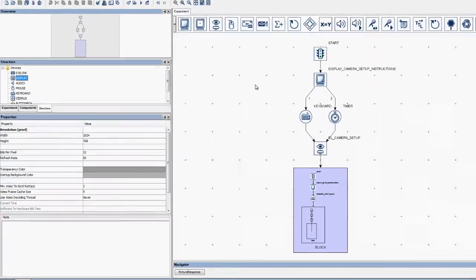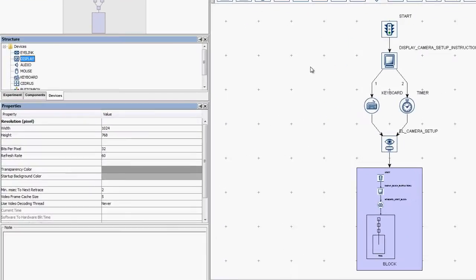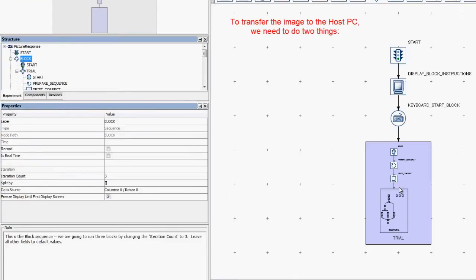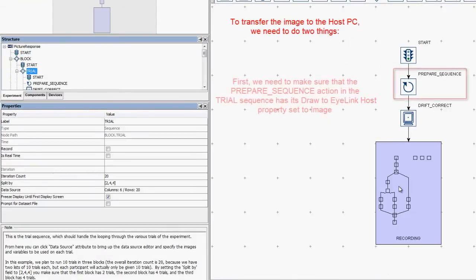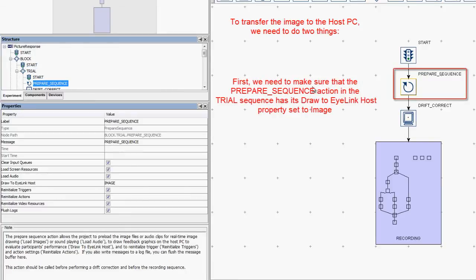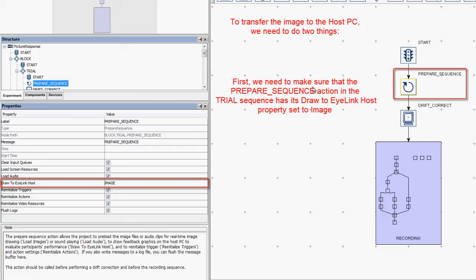To do so, we need to do two things. First, we need to make sure that the prepare sequence action in the trial sequence has its draw to EyeLink host property set to image.